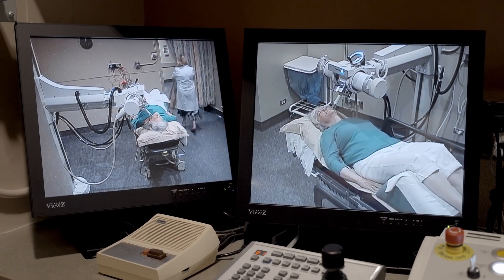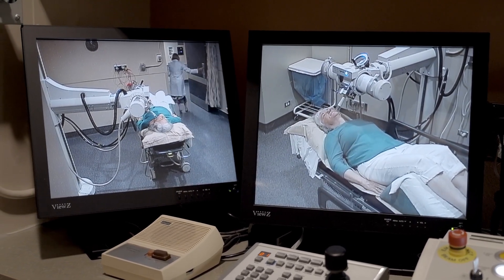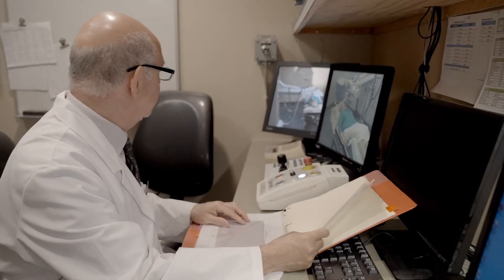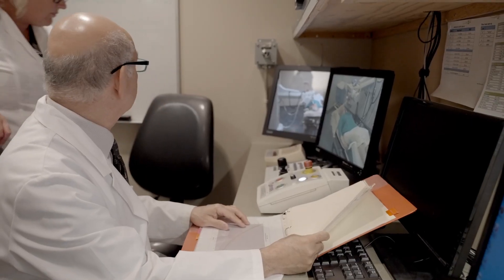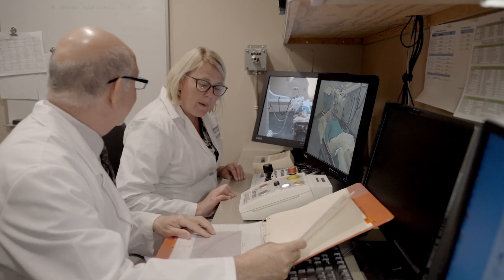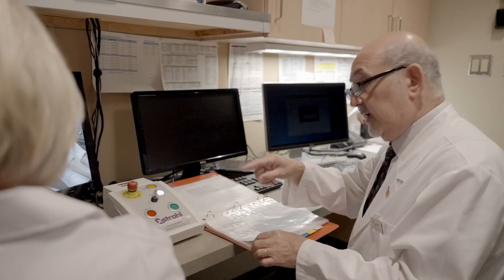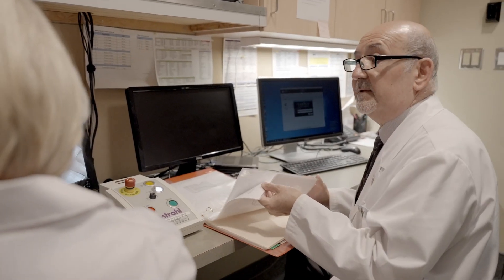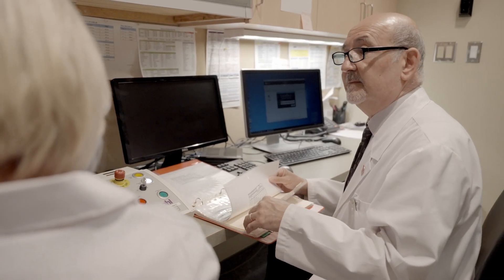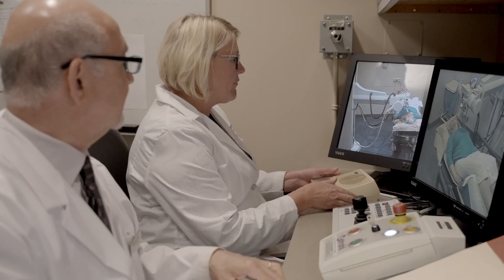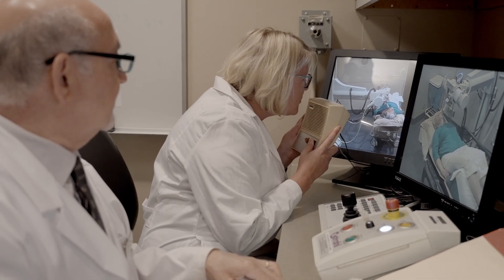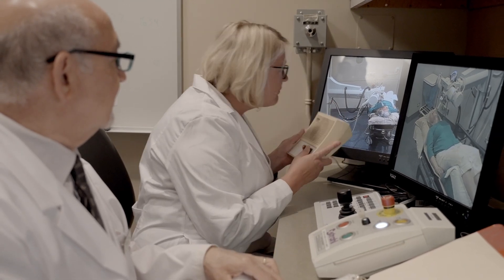Once the machine applicator is lined up to the marks on your skin, the treatment radiation therapist will then leave the room to begin your treatment. Although you will be alone in the treatment room, the radiation therapist will be just outside in the console area and will be watching you on a camera. There is also an intercom system that allows you to speak with the therapist while you are in the room.